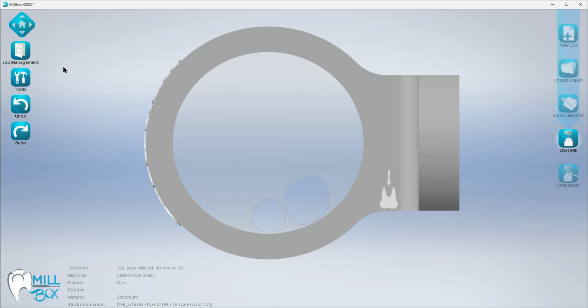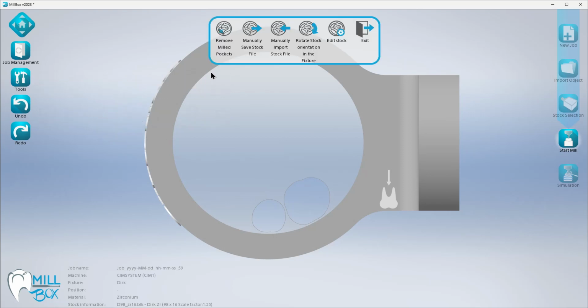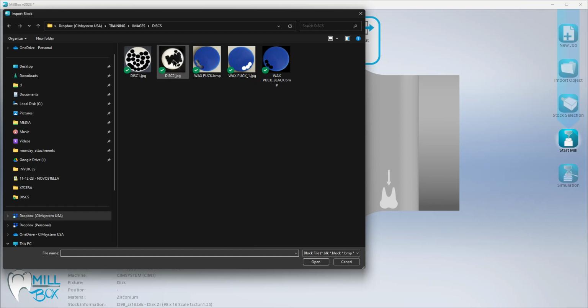So in this particular case, I've gone ahead and started a new job. I skipped past my import object so I could just import a disk. So I can simply go to Tools, and I'm going to go to Reusable Stock, and there's an option up here that allows me to manually import my stock file. And you can see I have options for formats down here. Bitmap, JPEG is one of those. I'm going to paste my path to get to my disk here.